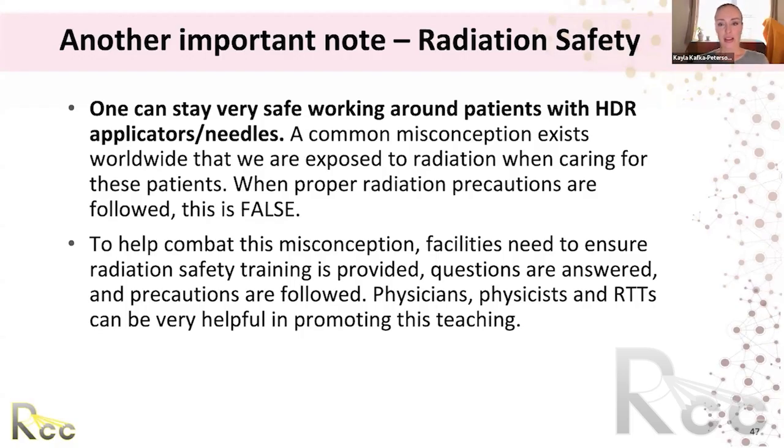And I always want to emphasize the importance of radiation safety training, because we can be very safe working around radiation, especially HDR brachytherapy. It's a common misconception that we are exposed to radiation when caring for these patients.